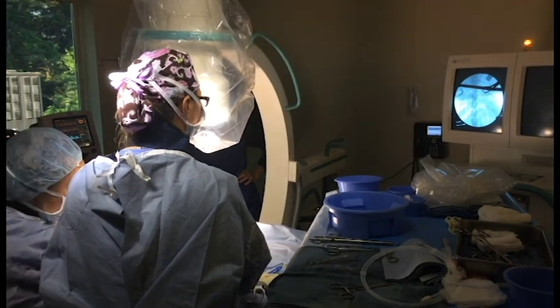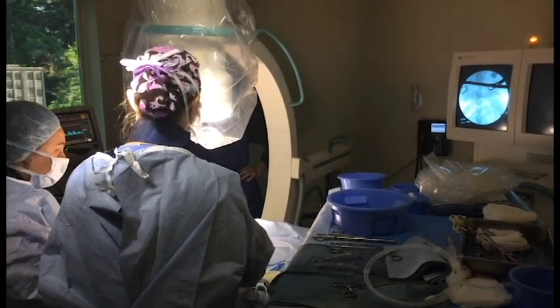We see a really quick turnaround, so we can take a dog who can't breathe and we can help them breathe better, and it's instantaneous. We can take a dog who can't urinate and can't pass any urine and help them urinate better. We can take a dog who feels pretty crummy and place this stent, and then all of a sudden, really quite quickly they recover and feel great, and it feels good because we're not having to cut anything out. We're able to preserve the function of these organs and give these guys a longer life.